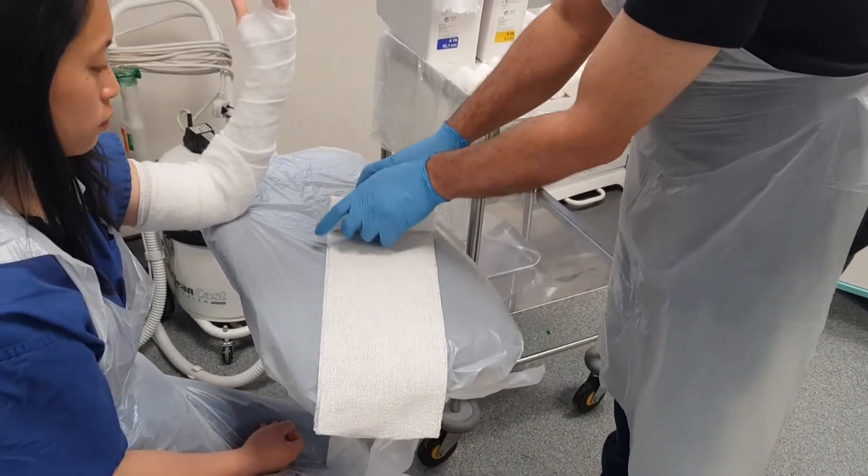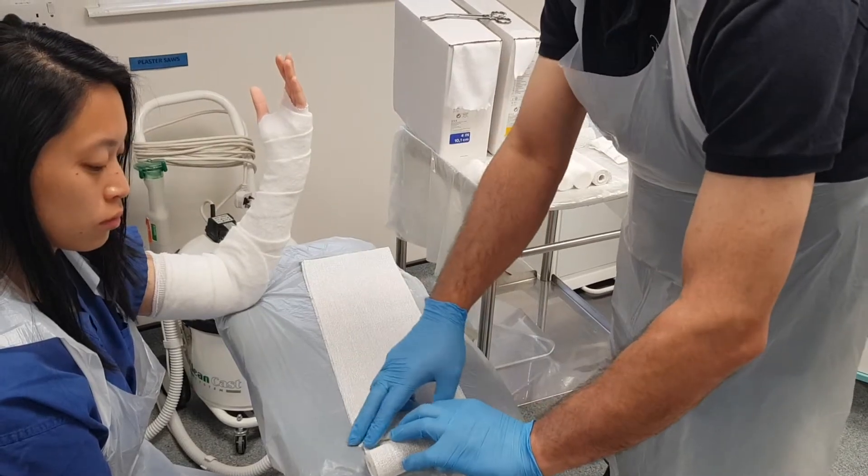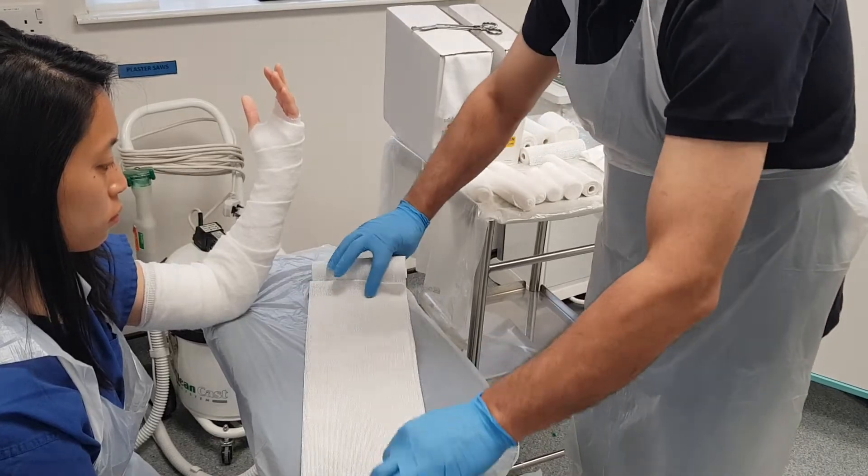Now the weak point of the elbow plaster is at the elbow joint itself, so we're going to reinforce this with a U-slab which goes around the elbow.